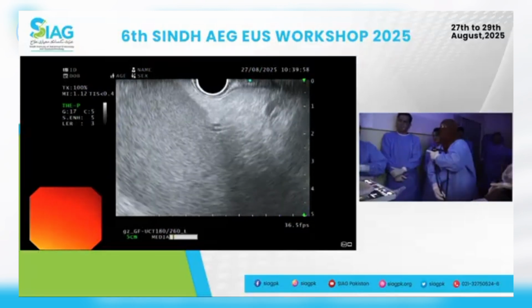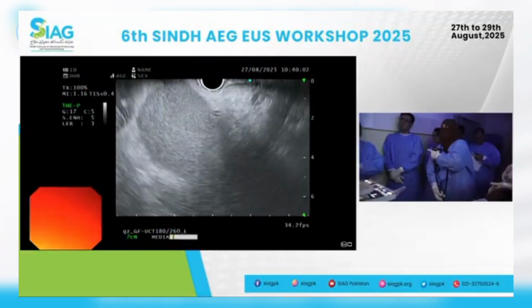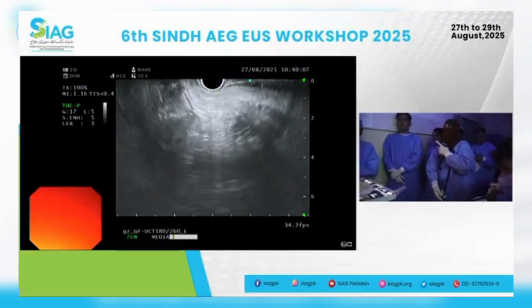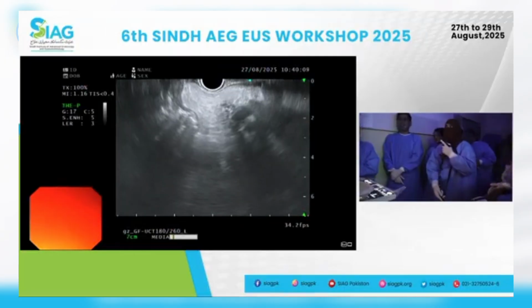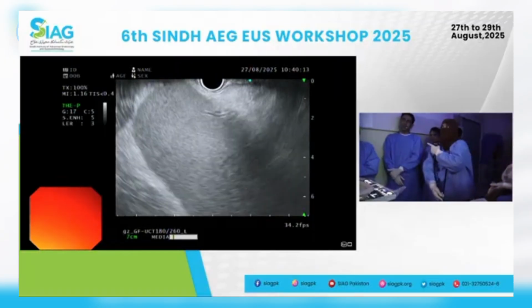कम कर दें इसकी तरह ना, ताकि स्क्रीन में पूरा हो. That's it, that's fine. वापस जी. Gently. And the moment you lose it, you're back on the pancreas.